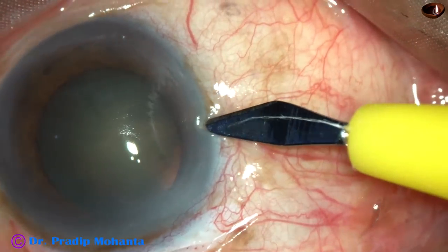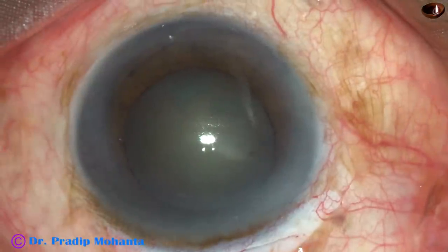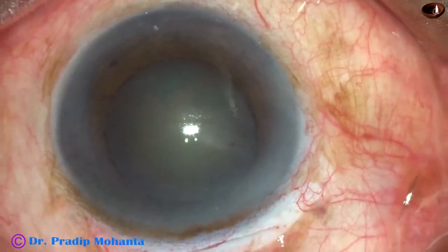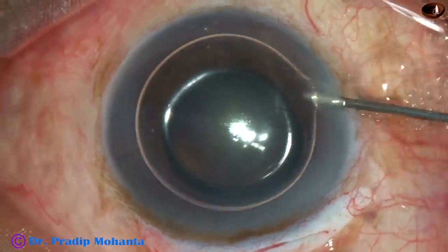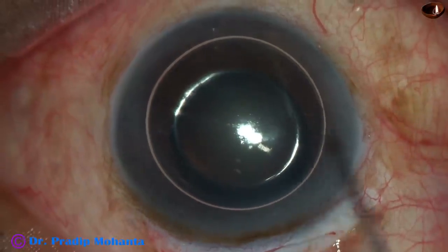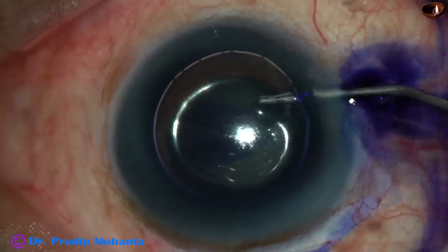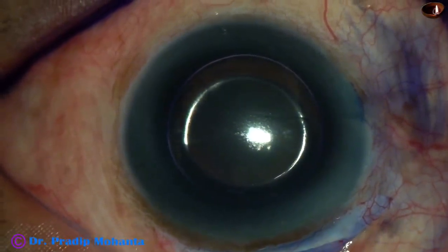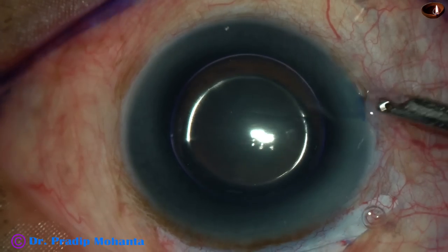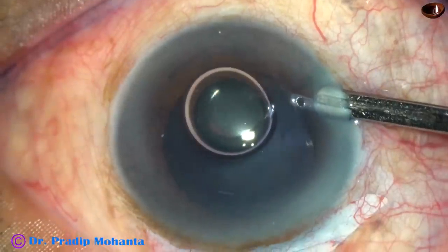Now make a side port at 9 o'clock and inject an air bubble. Many colleagues don't use an air bubble, but this is my routine practice. I use an air bubble, and beneath this air bubble I inject the trypan blue dye. Staining becomes very fast if we inject the dye under an air bubble.